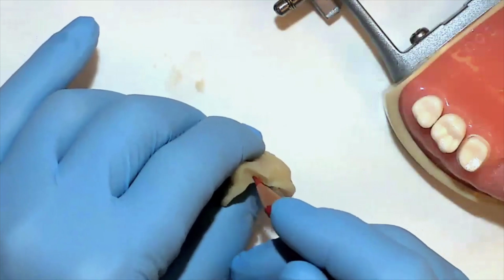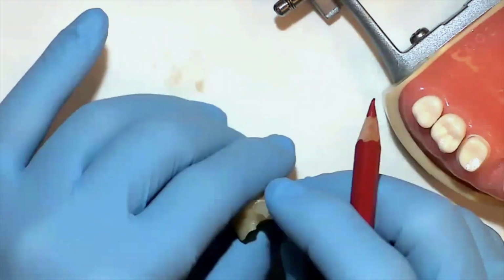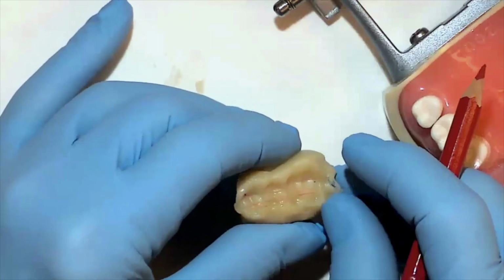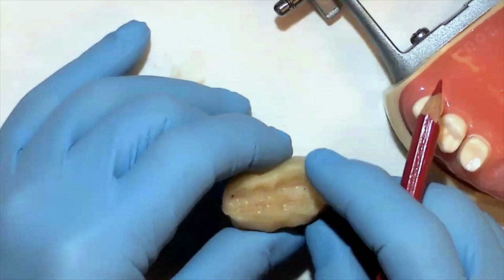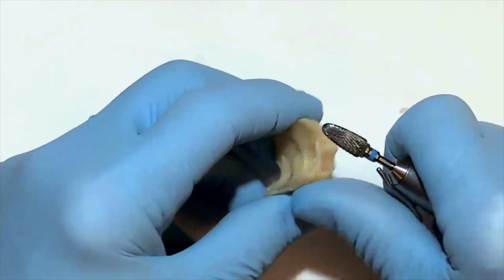We're also going to mark the contact areas with the adjacent teeth. These are areas as we're carving down our bridge we do not want to violate because it will leave us with an open contact. The block is now ready to begin carving, and we'll be doing that with an acrylic burr.